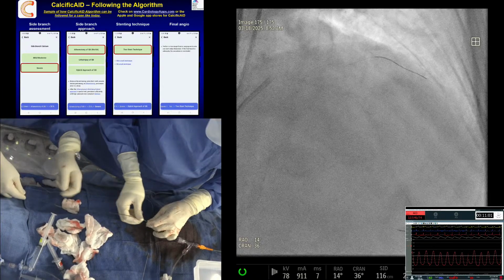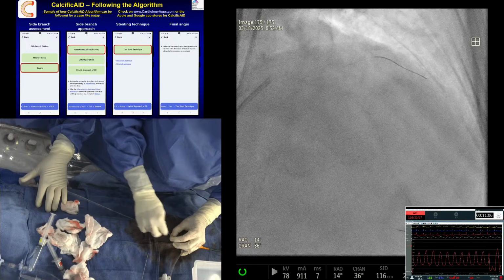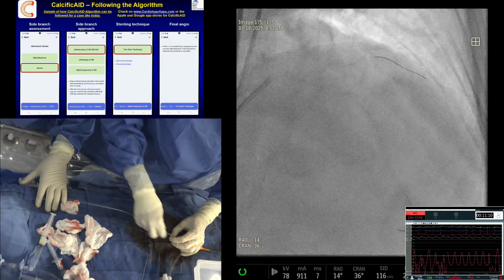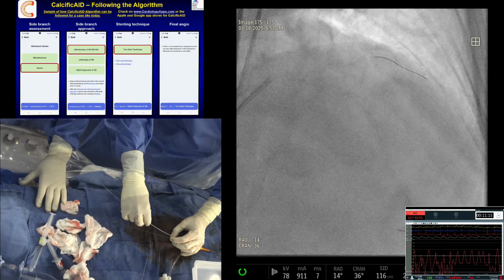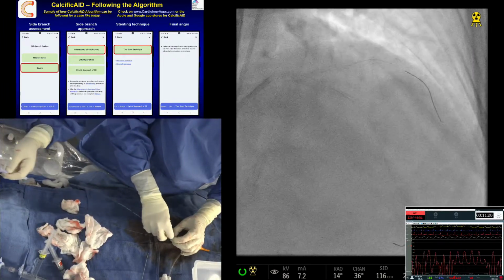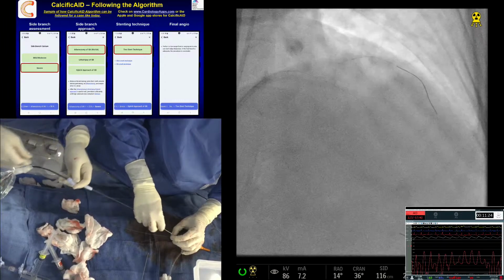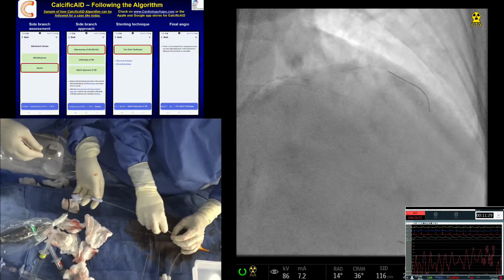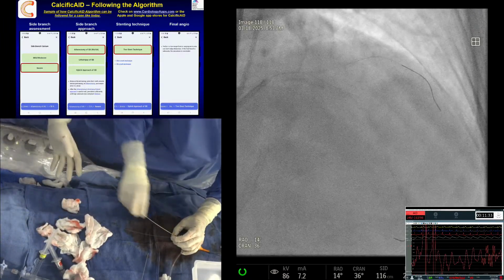Does the profile of the IVL catheter become an even bigger challenge when reintroducing? Yeah. I mean, the deflated profile is always the issue. And the bigger the catheter, 3.5 would have been even bigger trouble. The profile is higher. Okay. I won't say that. I think maybe 3.5 in the proximal LAD would have allowed us to. Okay, forget about it. I will not even waste my time. Good. Okay. Experiment is over.